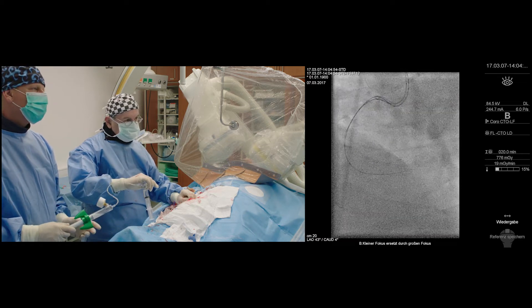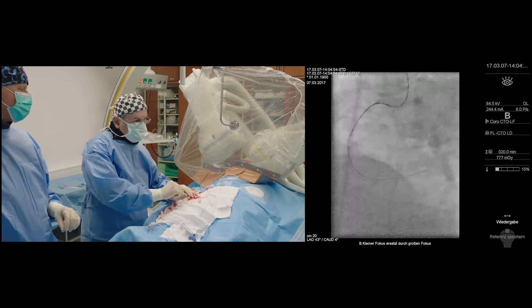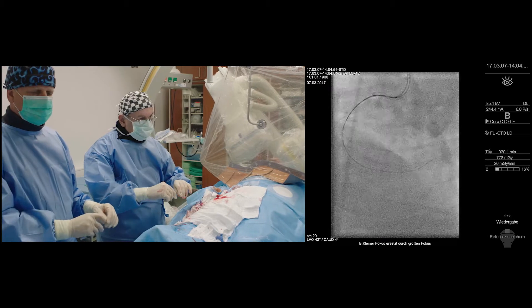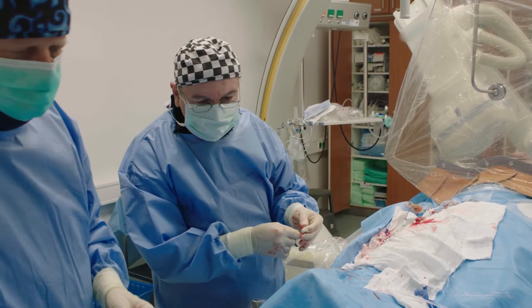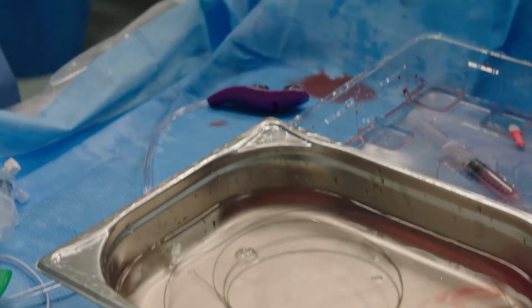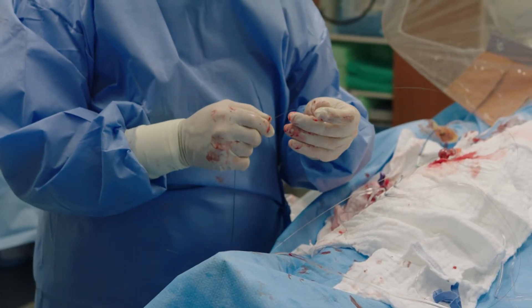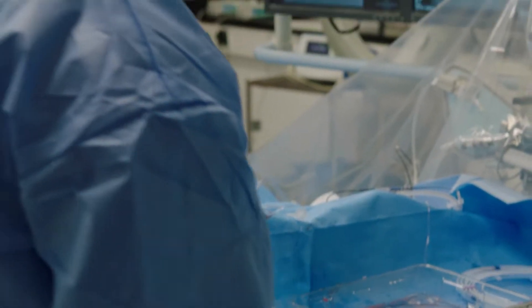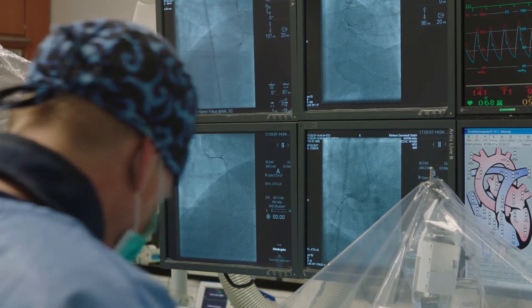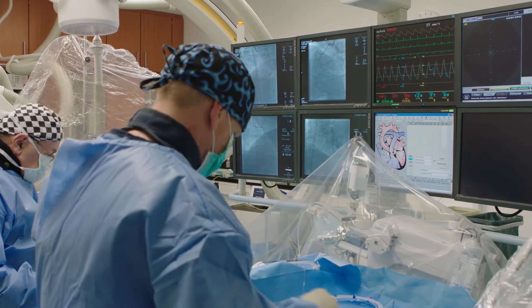A sub-intimal crossing and re-entry. First thing is to now exchange this stiff Confianza to a softer floppy wire, because we don't want to make any damage there. We have still our anchor trapping balloon in place. We take the fine cross and trap the 2.5 balloon in the guiding catheter while I advance to hold the Confianza so it doesn't slip forward while I advance the fine cross. We don't give any anterograde injection here — we have IVUS on the table. We don't want to propagate the dissection. We can take out the Gaia now, and we just have our Xion Blue. Then we give heparin.